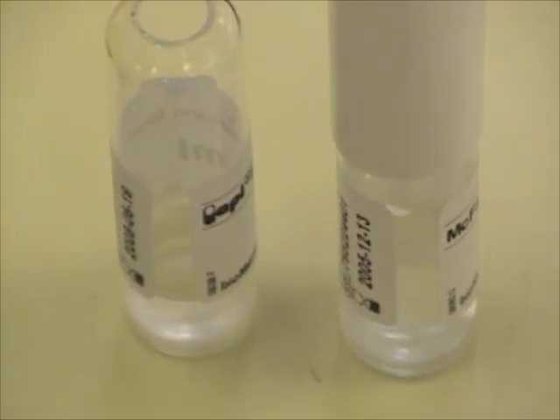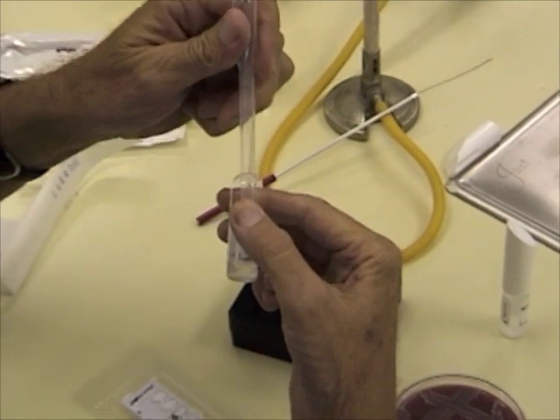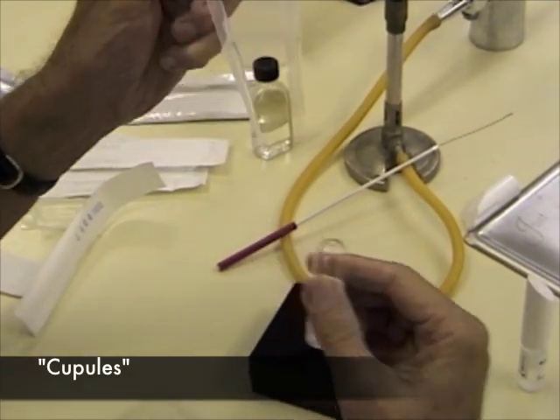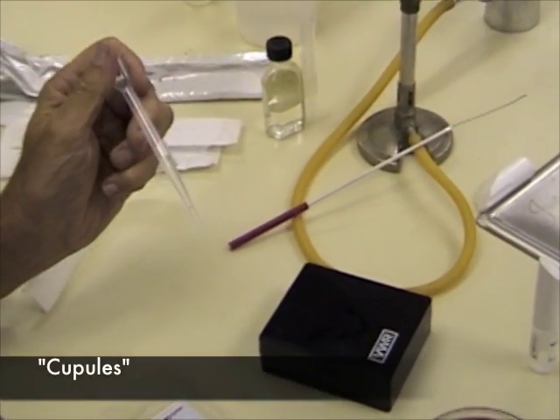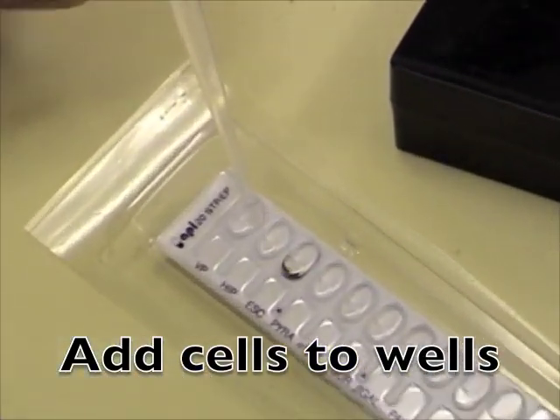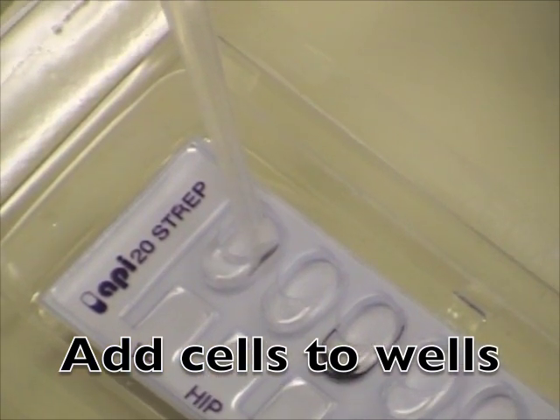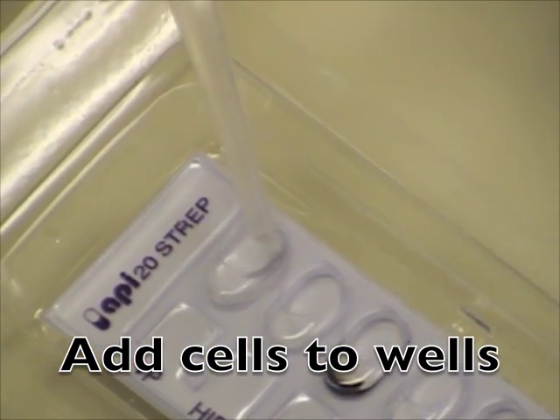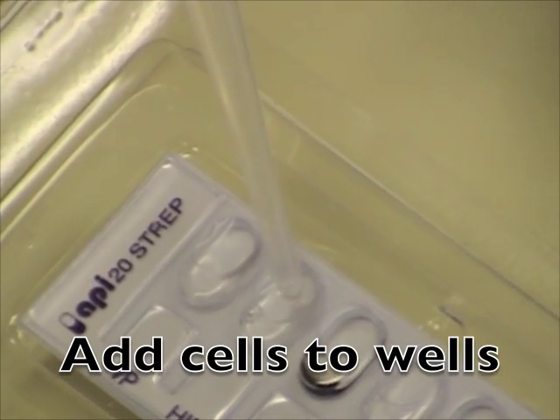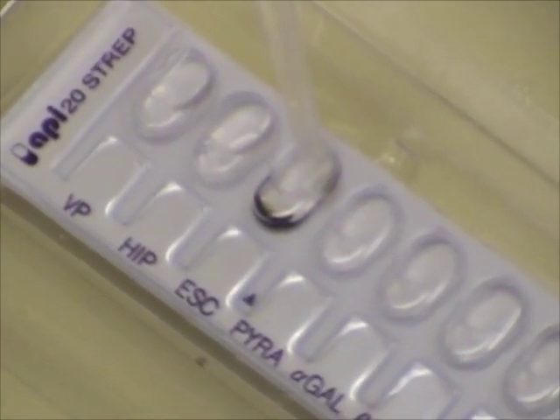These look pretty close — Bill did a pretty good job here. Then you're going to add this to the little test tubes, which are called cupules or wells. To get it into these wells can be kind of a challenge; you need to let it drip down the side and the inside of the cupule. Make sure you avoid any bubbles.